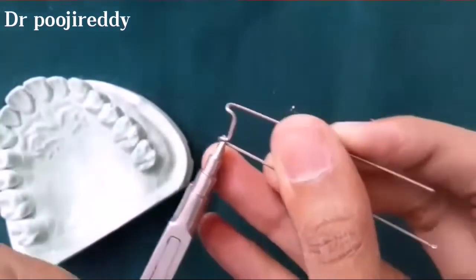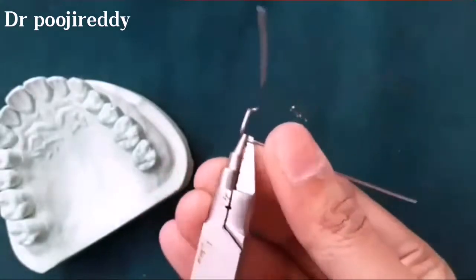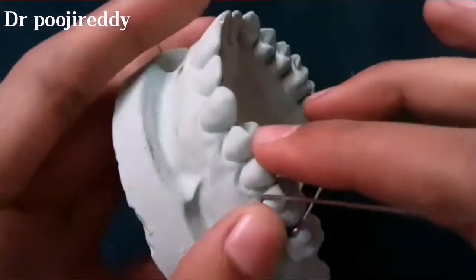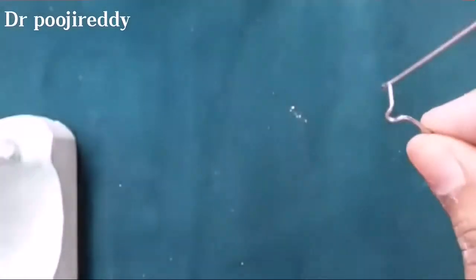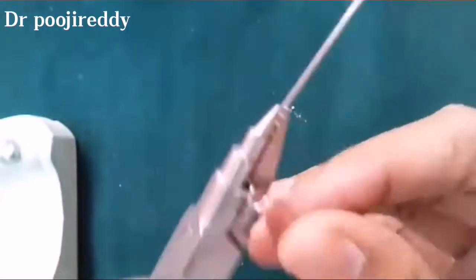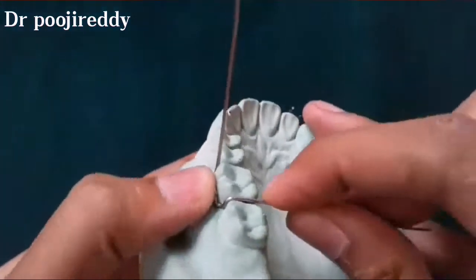Now the tip of the universal plier's beak is placed in half of the arrowhead and bend. Now by placing the universal plier onto the bridge of the Adams clasp, adjust the free end to rest in between the tooth surface.